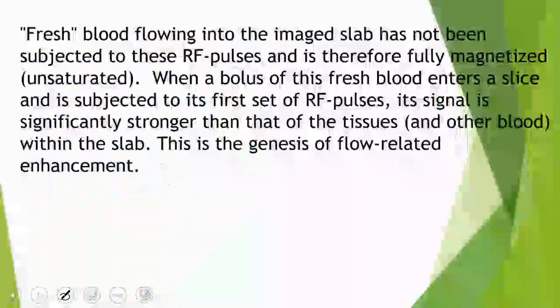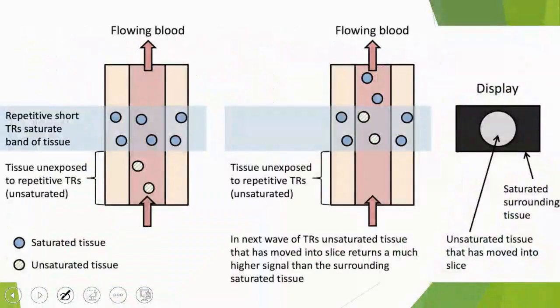When you come here, what are you doing? You are applying repetitive short TRs to create a saturation band. Do you remember the topic? If you go and focus on MR, they will tell you to create a saturation band.